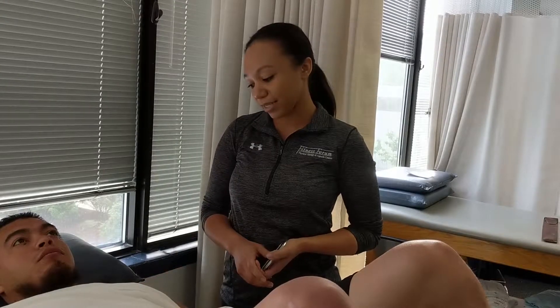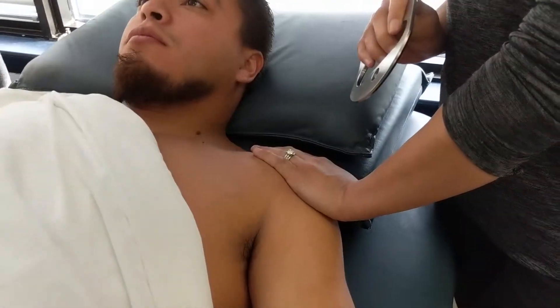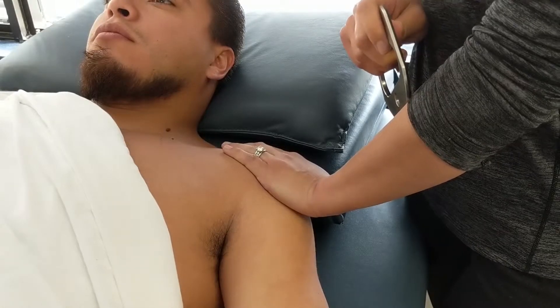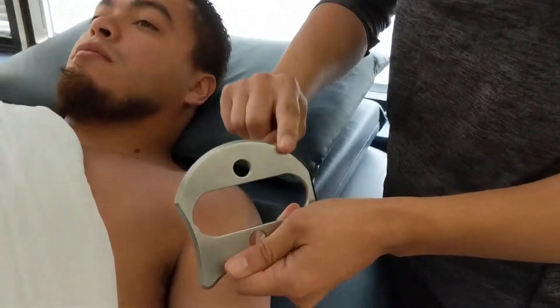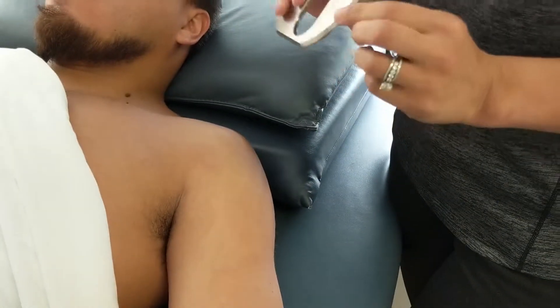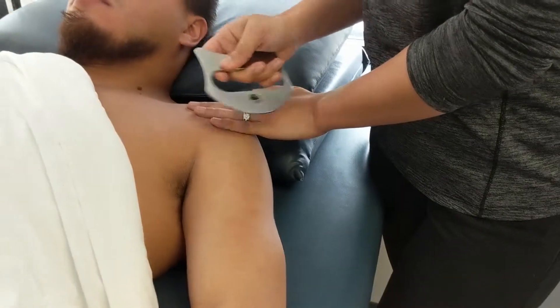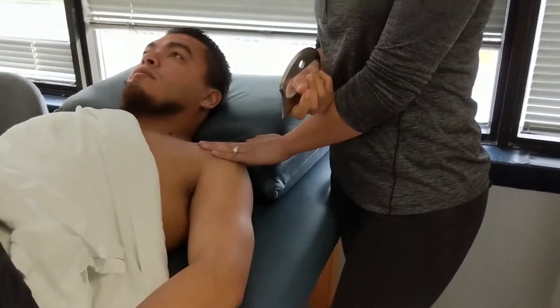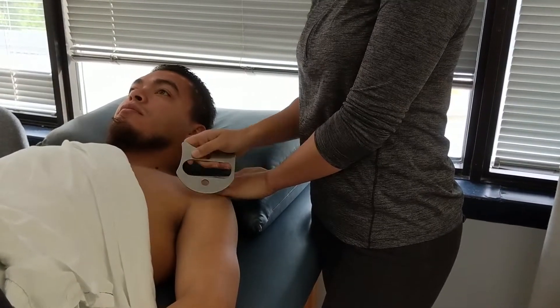We'll also use lotion — you apply a little bit of lotion to the skin, which I've already done, so he has some lubrication. You always want to traction the skin when you are using the tool. I've already assessed his mobility and pain. With each tool you'll notice there is a dull and a sharp edge. The first thing you want to do is scanning, and I'll typically use that dull edge — you go through and scan the tissue. If you feel any bumps, that is usually some increased tone, and you want to go nice and slow over the skin to try to reduce that tone and reduce that tissue tension.